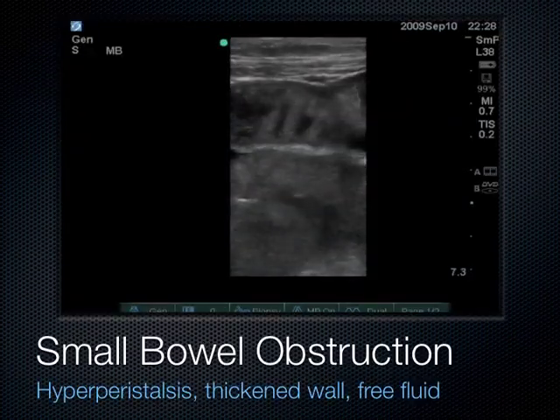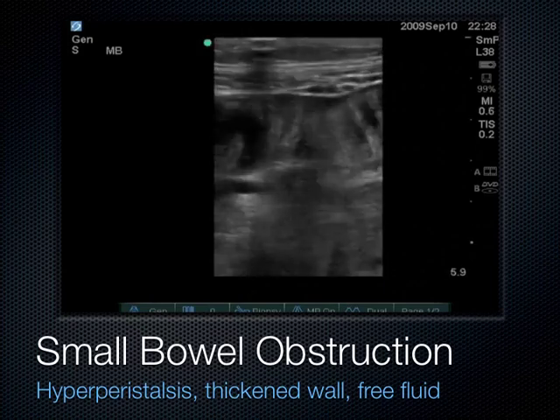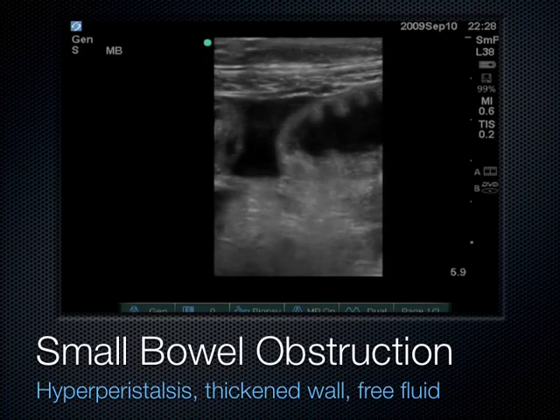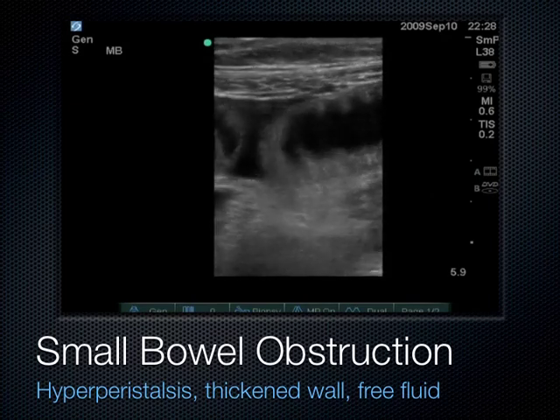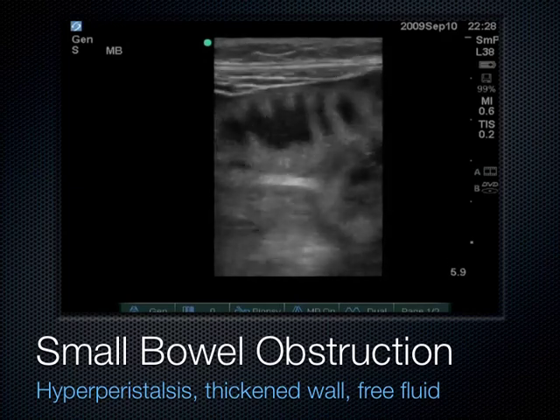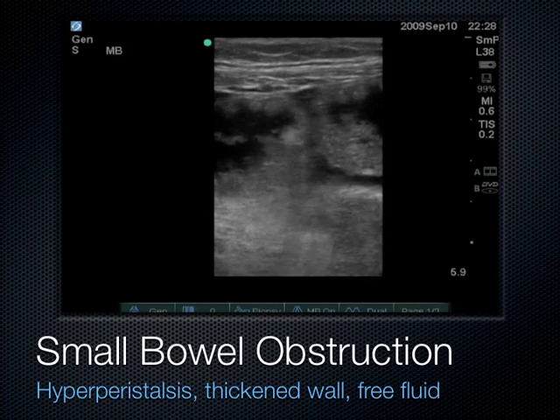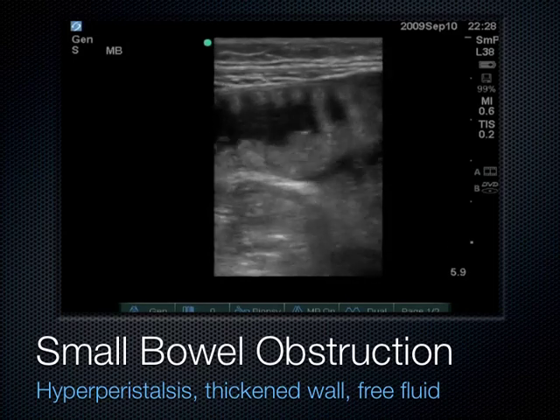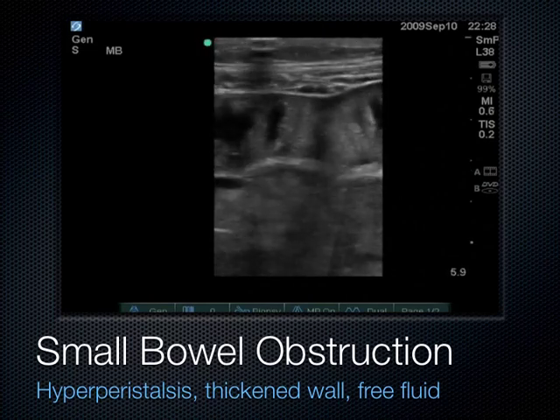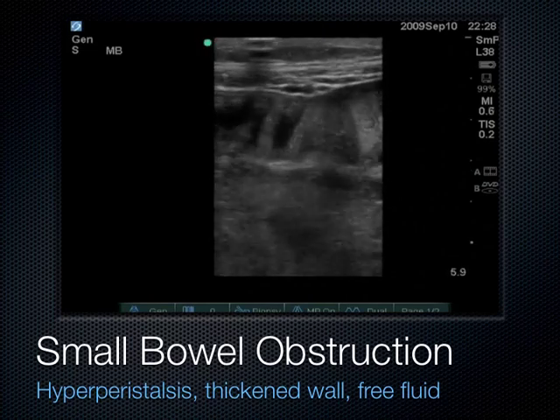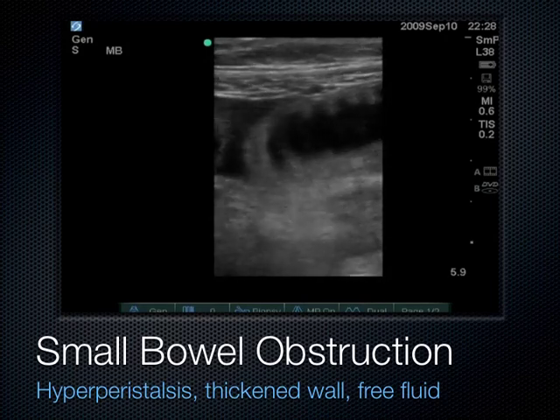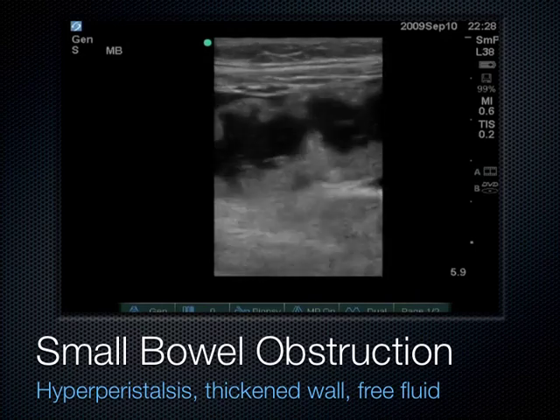In another example of small bowel obstruction, the plicae circulares go all the way across and walls are thickened. If we look adjacent to the loops, there's free fluid between them. When you see free fluid between two loops of bowel in a patient with small bowel obstruction, that's a surgical emergency — the presence of free fluid suggests microperforation and the patient needs to go to the operating room.